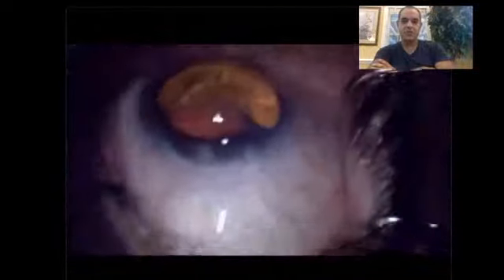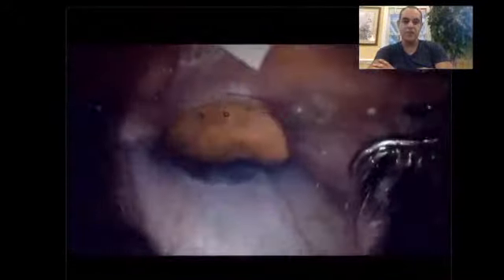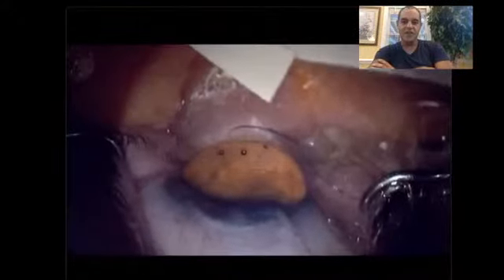And we're just going to spend a little bit of time here kind of getting things aligned and in focus. Obviously, this is an unedited video. Typically, when I get these all nice and pretty for YouTube, we edit all this out. But this is a live stream, so we get a chance to talk and discuss some of these things as we go through them.